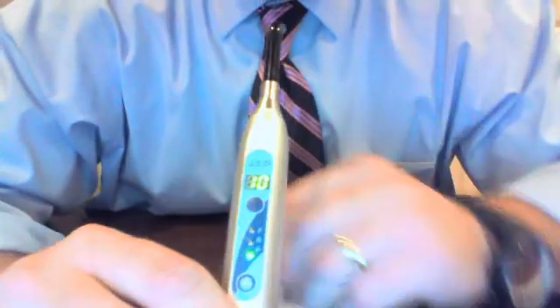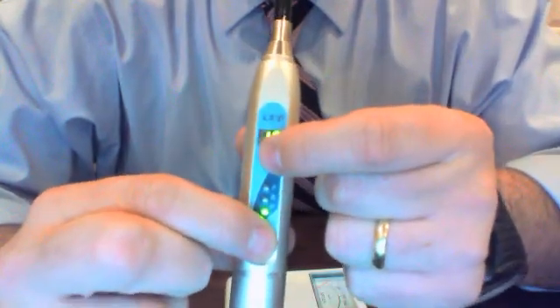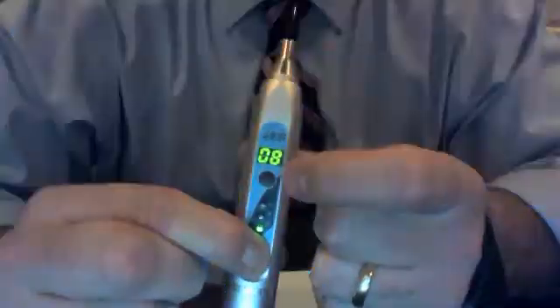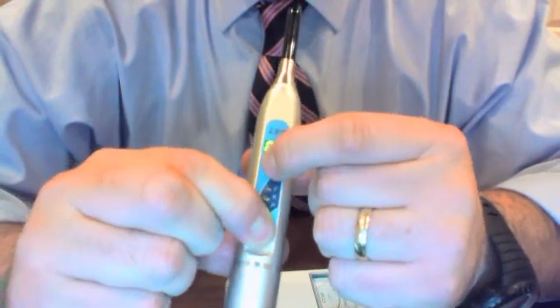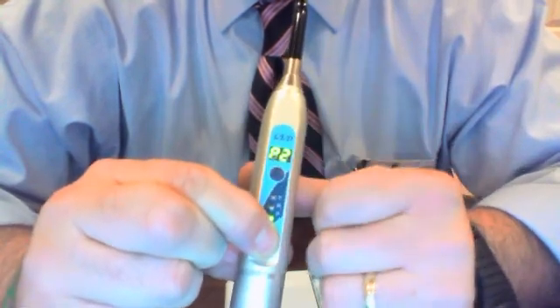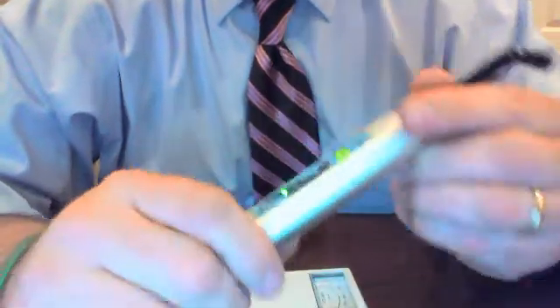You can toggle between programs by holding both the power button and the program button down simultaneously. Now you can see P2 and P1 — P1 being half power, P2 being full power. Now we're back on full power. And that's pretty much the CureFX light.